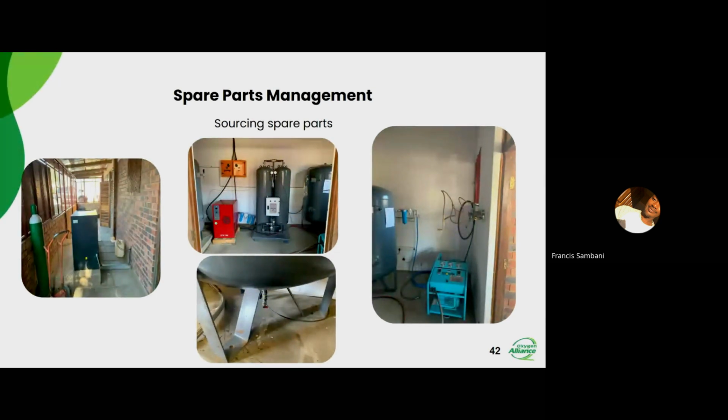We had to change it to put it before the tank, which you can slightly see on your left in the same middle picture. So we had to change it so that we have the air dryer and then the filtration after the air dryer, and then that goes to the air storage tank, so that you have clean air in the air storage tank. After the storage tank it goes to the PSA generator, then the OST.